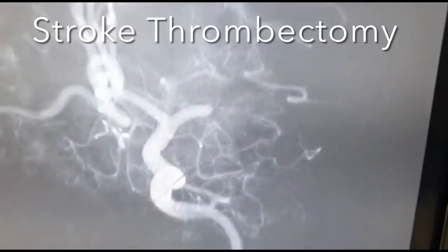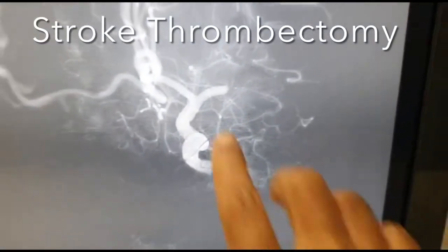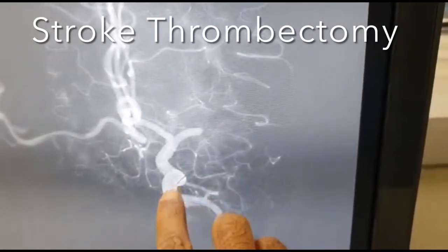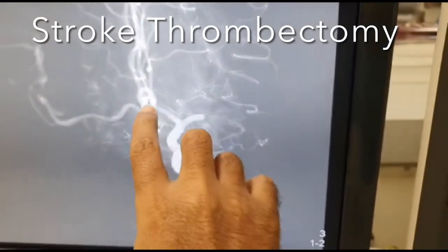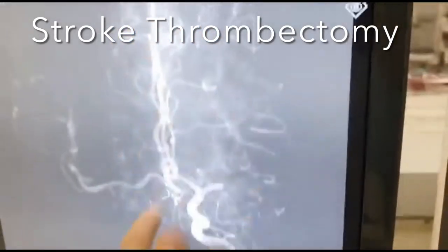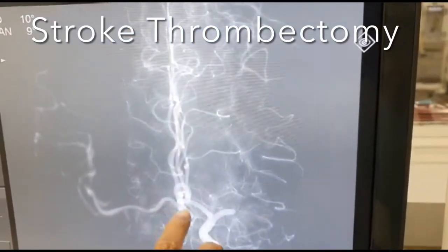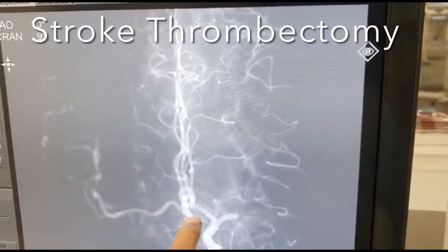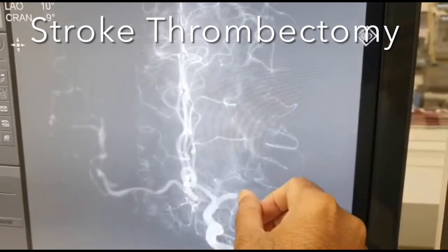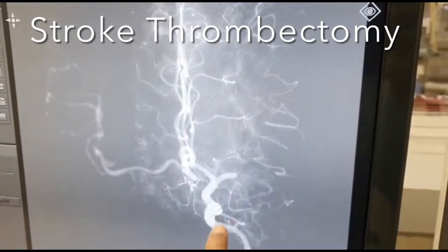This is the roadmap which shows the M1 occlusion. This is the internal carotid artery, A1, both ACA and opposite MCA which is filling through the collateral. We can see the occlusion at the M1.